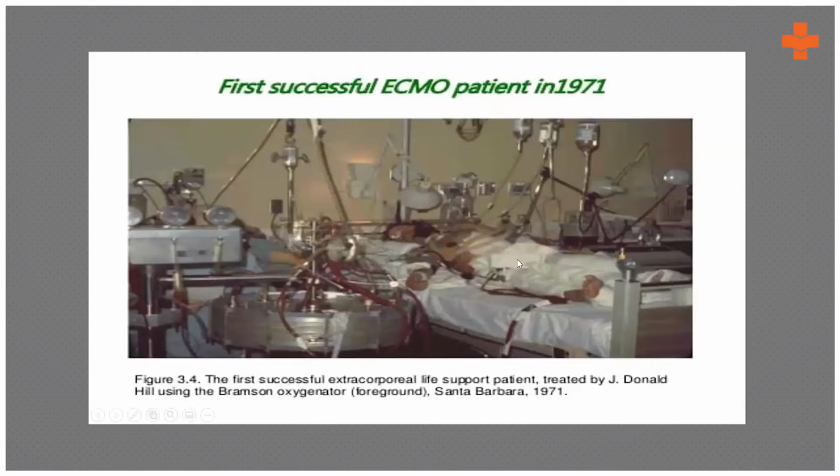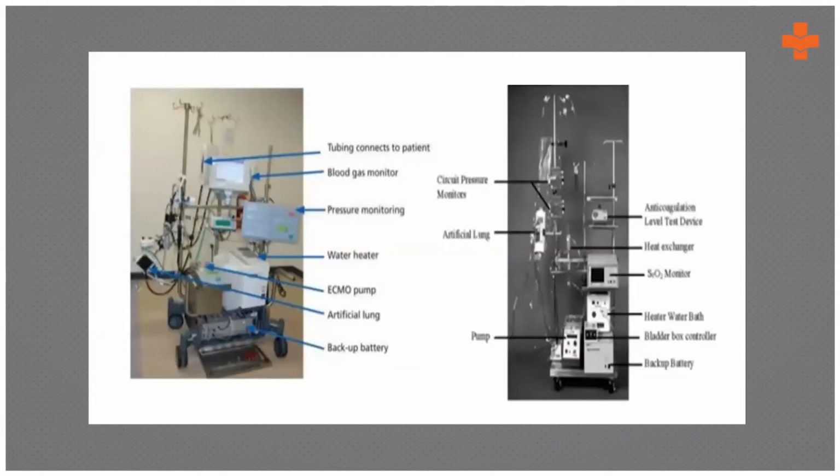So this is how in 1971 the ECMO machine with the patient used to look. Very confusing, very large, lots of pipes. And this is now how compact the ECMO machine looks in the present day.